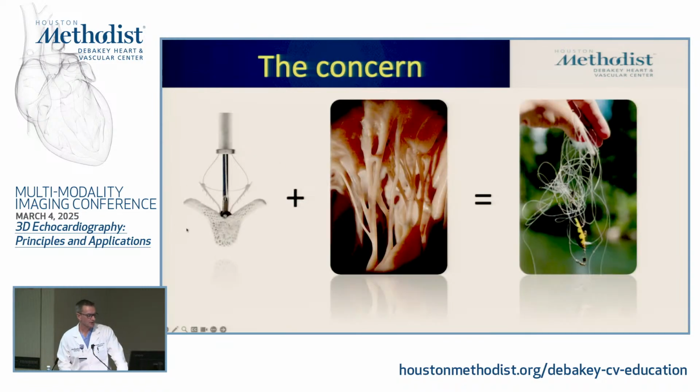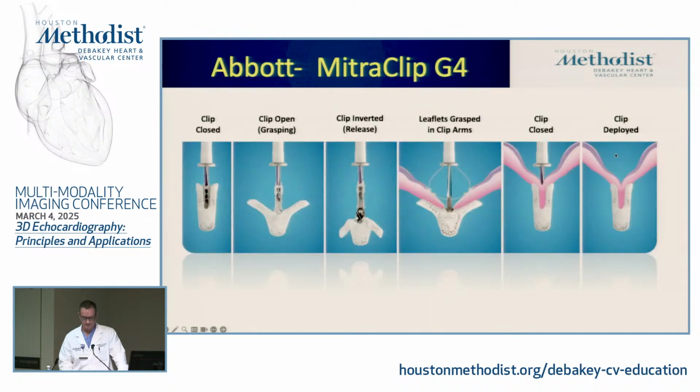So this is what you're trying to avoid. This thing that looks like a fish hook, this that looks like weeds, and this sort of outcome. If you get to here, that's a bad day for everybody. So you're very cautious how you orient, how far you go down, using all elements of echo, 2D, 3D, color, X-plane, zooming. You're doing everything to avoid the outcome on the right.